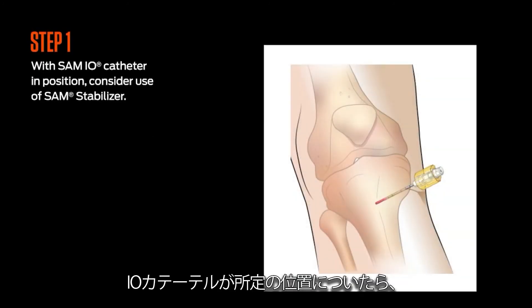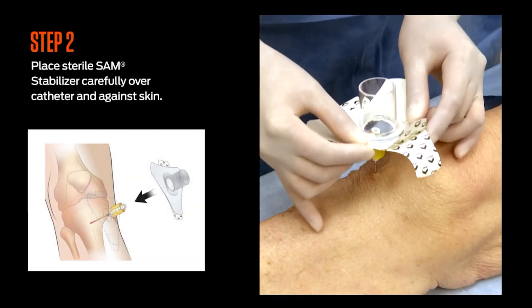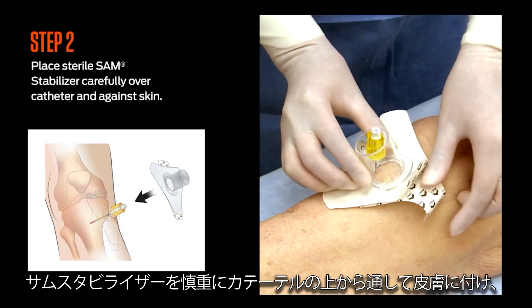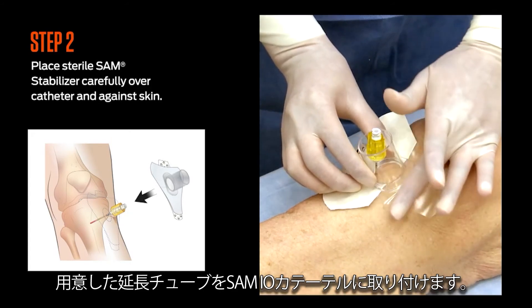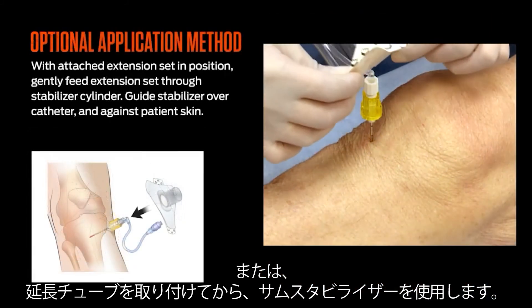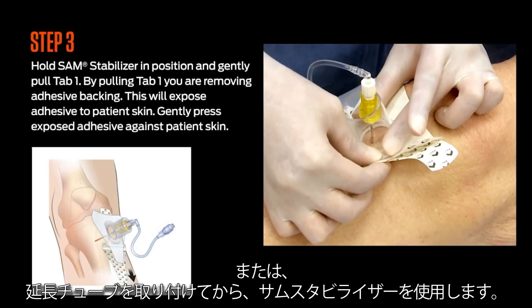The following is supplemental material. With the IO catheter in position, consider using the SAM-Stabilizer. There are two methods to attach the SAM-Stabilizer: place it carefully over the catheter and against the skin, then attach the primed extension set to the SAM-IO catheter; or alternatively, attach the extension set first and then apply the SAM-Stabilizer.